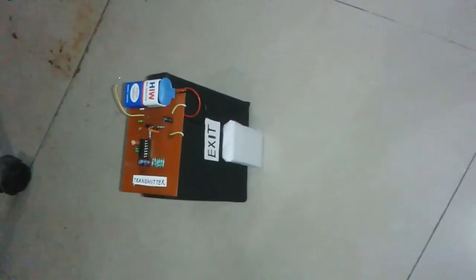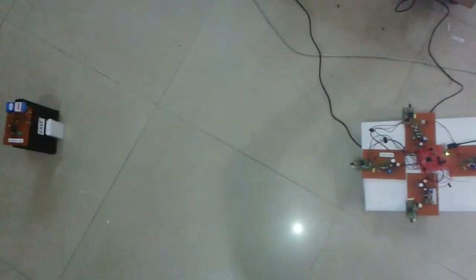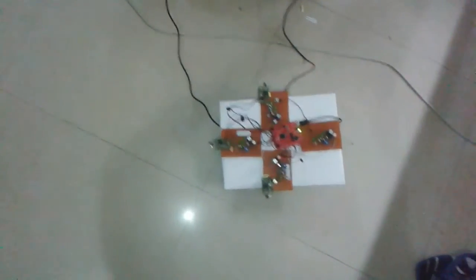The algorithm of the overall setup works in such a way that it not only traces the transmitter and reaches the person in need, it also avoids the obstacles lying in the path, thereby making way for the safe exit of the disabled person.